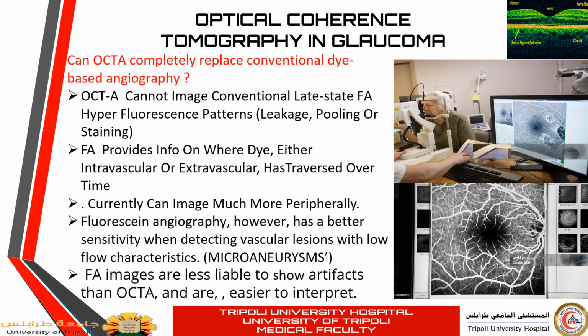The question arises: do we still need the fluorescein angiography? Although the revolution of OCT angiography has made a lot of things easy, with acquisition of high resolution images without injection of dye, and visualization of the different layers of the retina, making it a very useful technique to diagnose many diseases of the retina, there are some disadvantages of OCT angio.